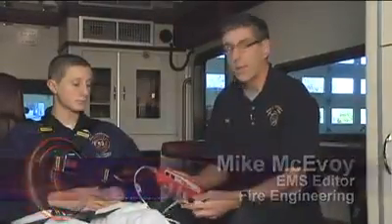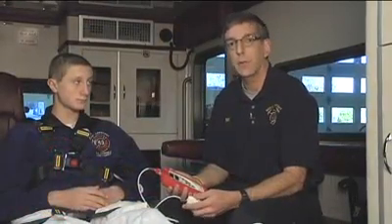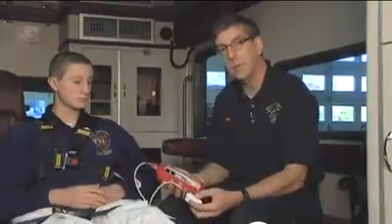Hi, welcome to Training Minutes. Today we're going to talk about using pulse oximetry, which has been added to the first responder and the EMT curriculum. Pulse oximetry is a method of determining the oxygen level in the patient. It has many limitations.